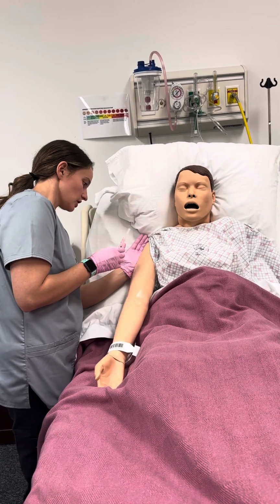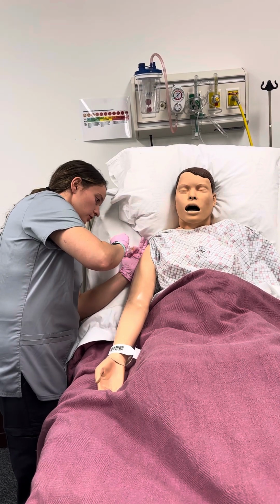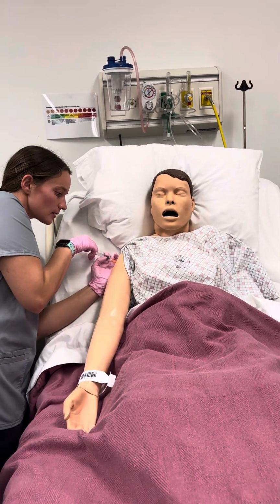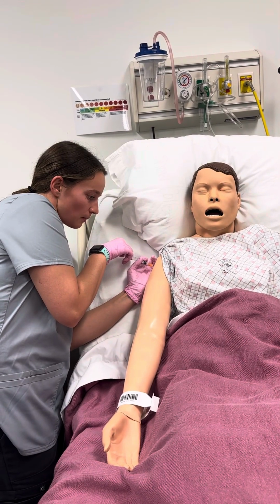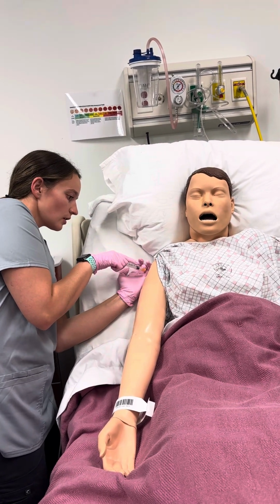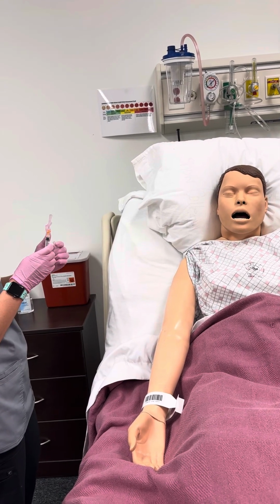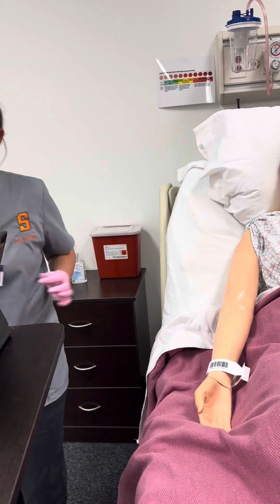So I'm gonna pull this aside, take off the cap, and insert the medication at a 90-degree angle. I'm gonna hold the medication like this and insert the medication very slowly. It's about 10 seconds per milliliter. Okay, and then I'm going to pull out the needle and my hand. I'm gonna put the safety on the needle, and then I'm gonna throw this away in the sharps container. And then I'm gonna just put this right here.